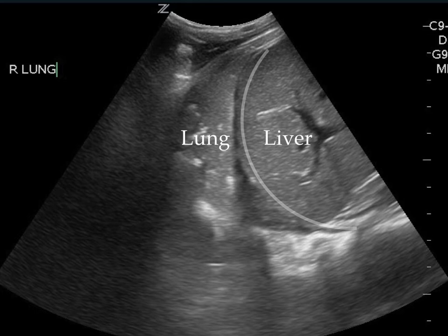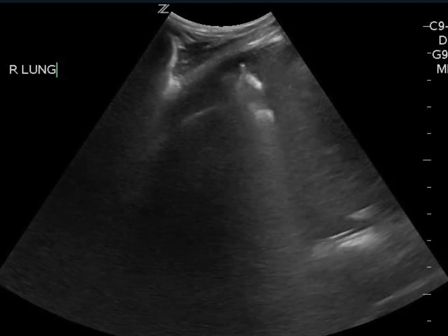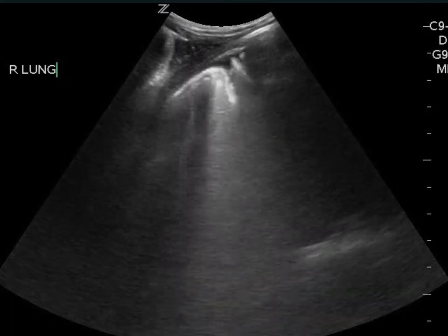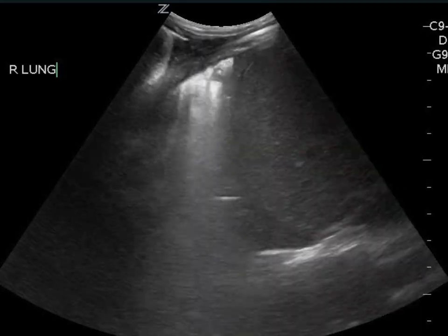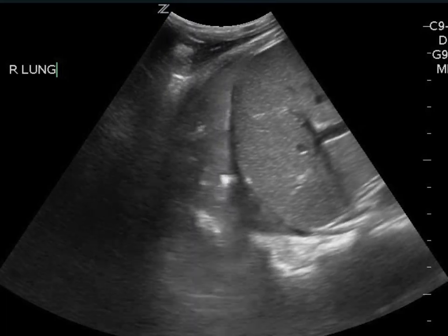It looks to be almost the same echogenicity as the liver, which is why we call it hepatization. We can also see the spine above the diaphragm, which tells us that there's a density above it. In this case, it's not fluid, it's lung. This is a lobar pneumonia that's sitting right on the diaphragm and above the liver. So this might be the patient that comes in with a cough, fever, and belly pain because it's irritating the diaphragm. Okay, so we've gone through all that.